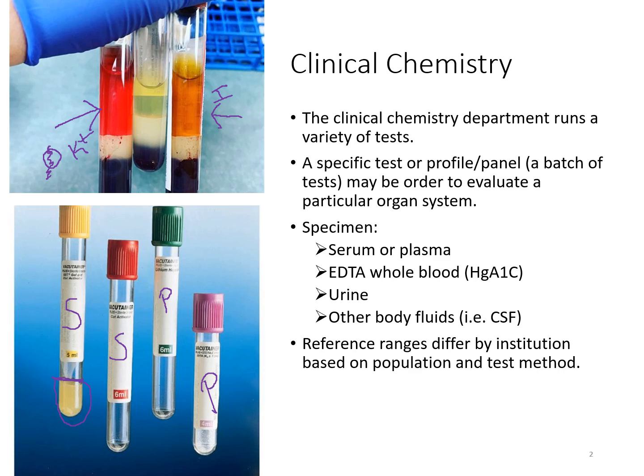You can also have some other interference due to the color if it's a spectrophotometer type assay where it's checking for a color change.